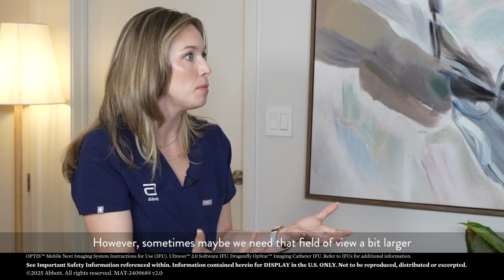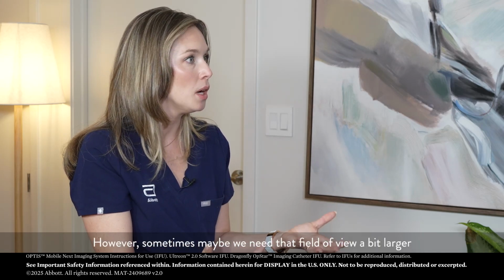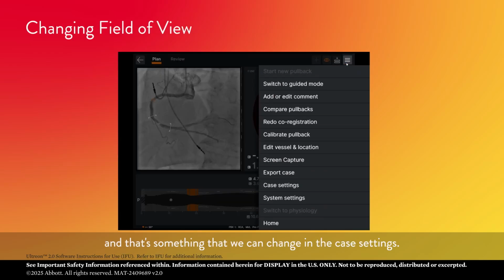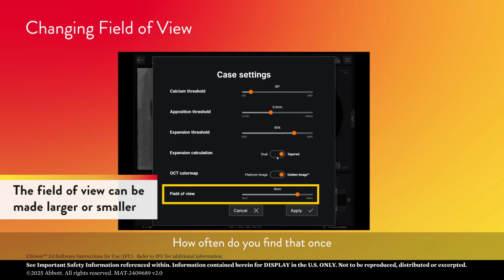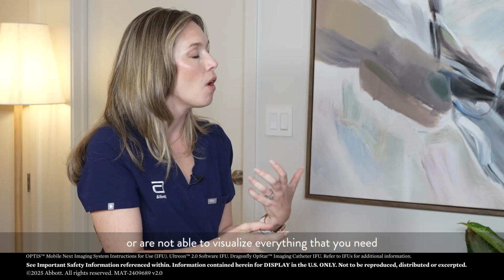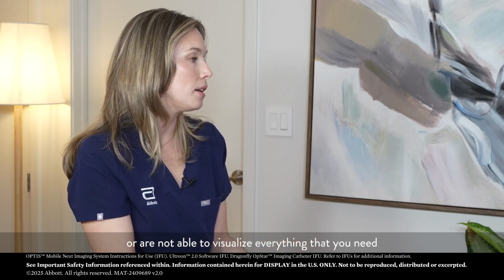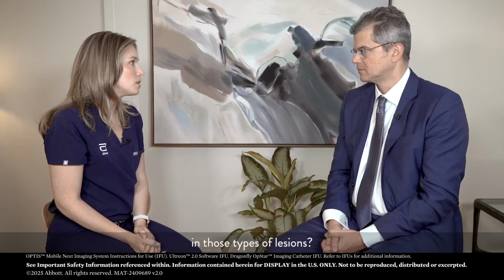However, sometimes maybe we need that field of view a bit larger. And that's something that we can change in the case settings. How often do you find that once you adjust your field of view that you are or are not able to visualize everything that you need in those types of lesions?